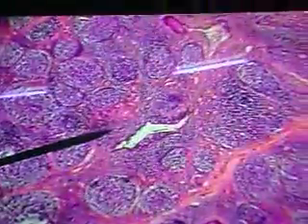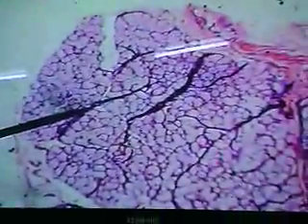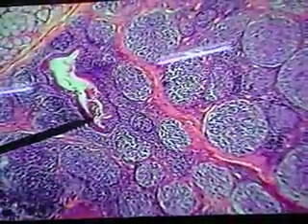I think this slide was fantastic, but missing some features. Alright, so this was a really hot-looking palatine tonsil, but when I looked at it, there were certain things that were obviously missing. Okay, so there you see a mass of what? Lymphoid tissue. A partial capsule outside, so partially encapsulated. Alright? The epithelium there. So there you see the glandular tissue. Some stratified squamous epithelium. Alright, that's right here.